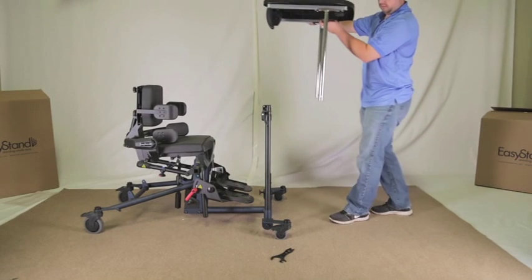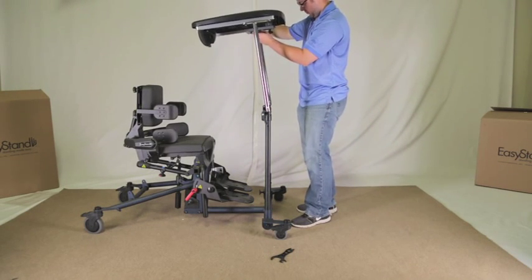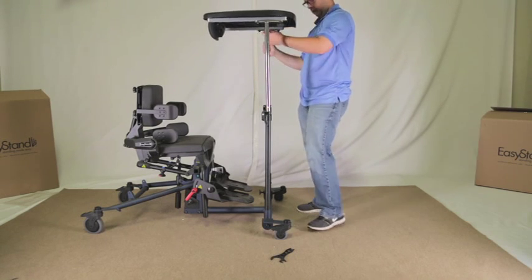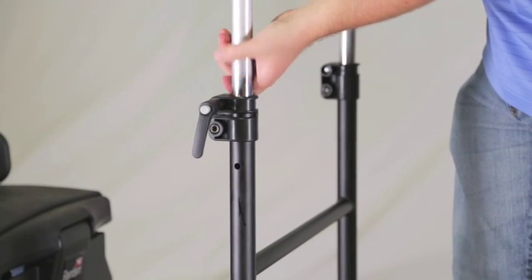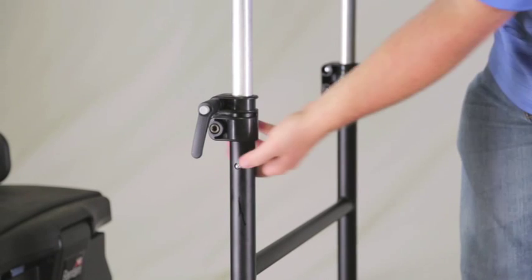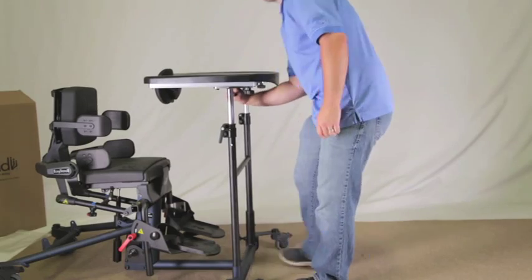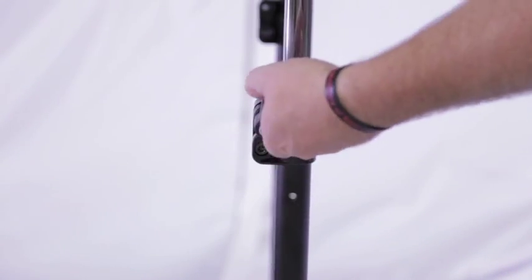Place the tray assembly onto the H-frame. Depress the spring button to allow the bracket to slide into the H-frame — there is only one spring button. The spring button will stop in the max height position. Once the clamp is cleared, the spring button needs to be depressed again to allow the tray to slide into position. Tighten knobs securely once the tray height is in the desired position.